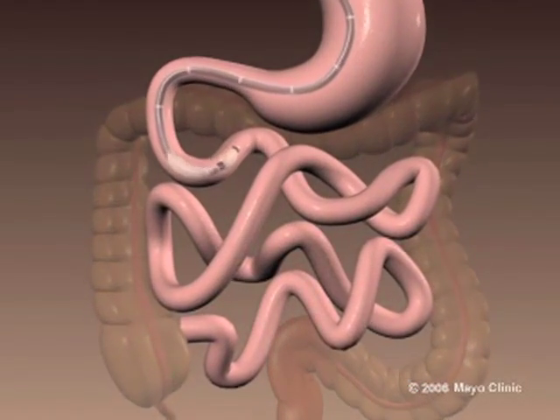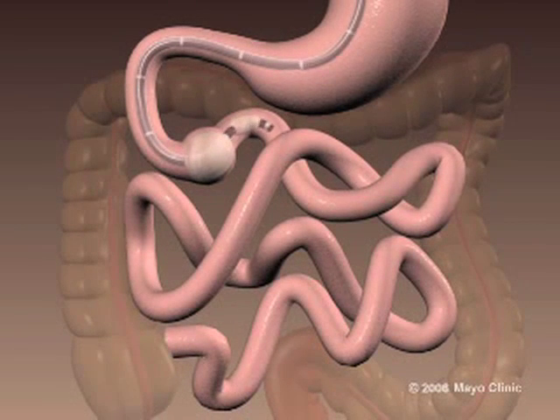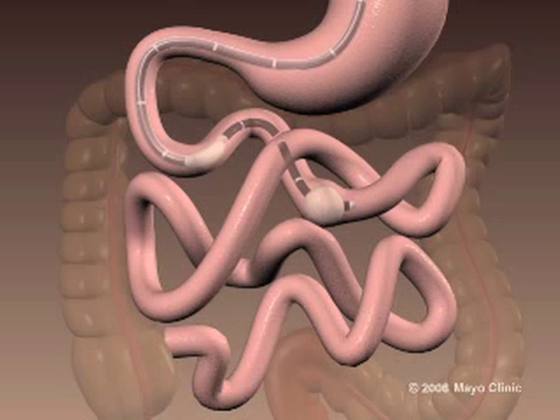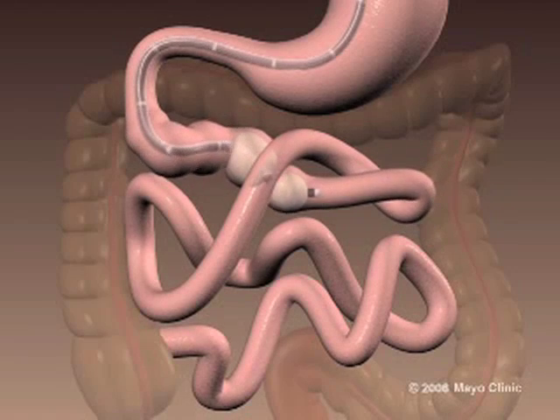There are several current techniques for endoscopy of the small intestine. In this method, known as double balloon enteroscopy, an endoscope and overtube, both equipped with a balloon at their tips, are advanced into the small bowel. By alternately inflating and deflating the two balloons, the small bowel can be pleated onto the shaft of the instrument.